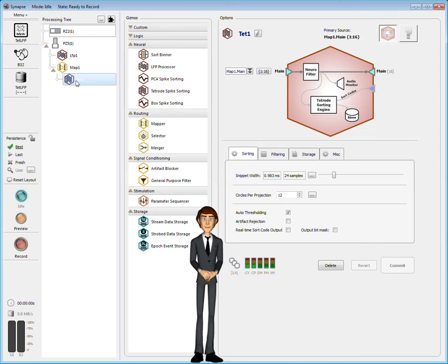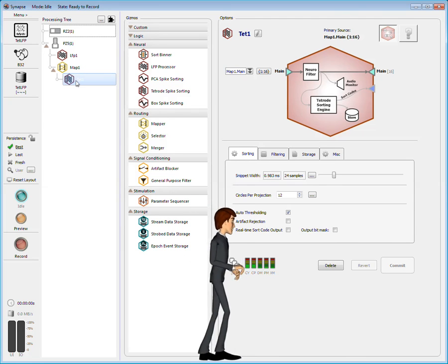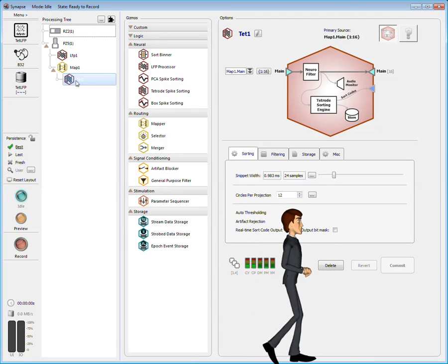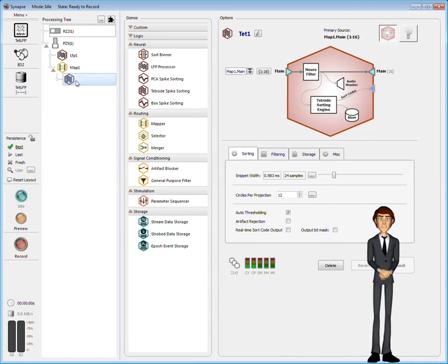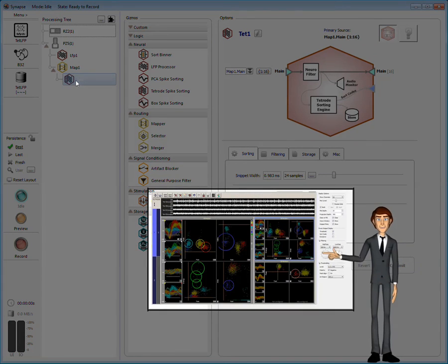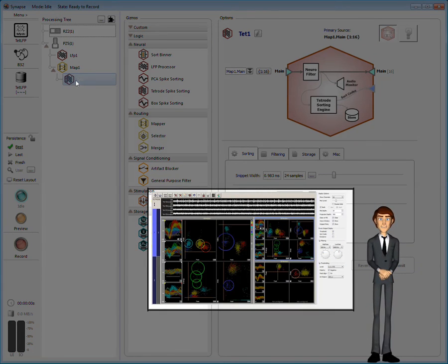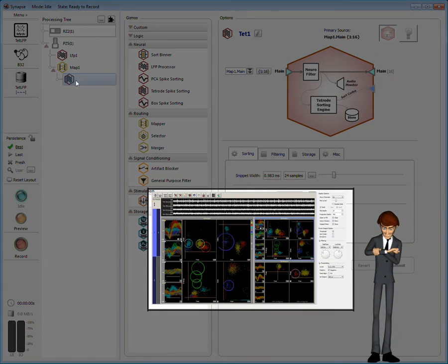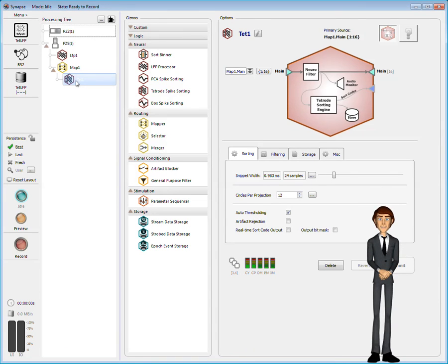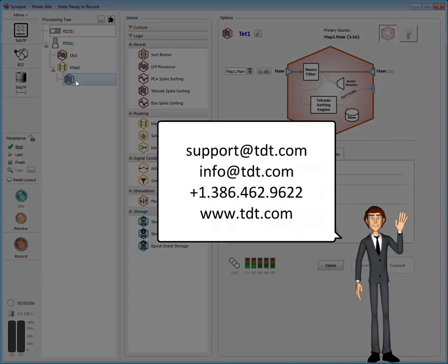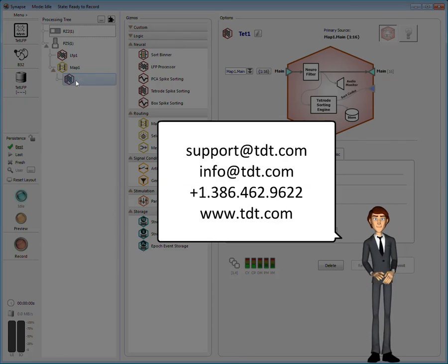The TetRoad spike sorting gizmo used in this experiment includes a fabulous runtime sorting interface, but we've run a little long, so I'll show you how to use it in a separate demo. Bye for now!